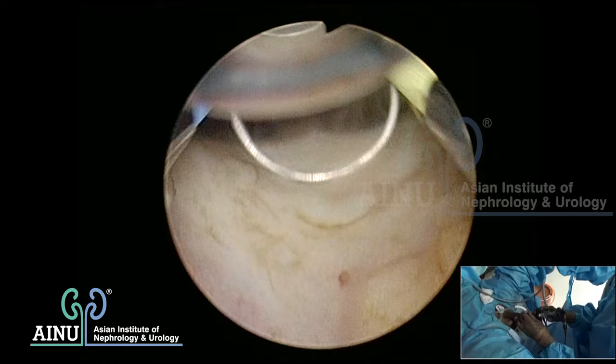Using a half-loop is the best way to know how much depth you are taking. Don't take the chip completely in the loop - only half - so you know the depth. You start creating a ridge, then cut the ridge to form a groove, then the next ridge is formed, cut that groove, and the next ridge forms next door. This is how you reach the capsule in all directions.